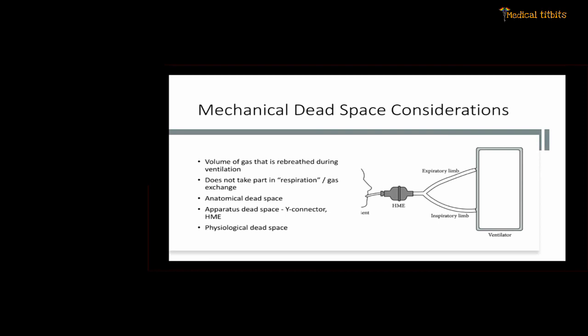So these factors may be playing around. As I said the other day, ventilation, the CO2 washout, depends on the alveolar ventilation, not the minute ventilation. Anyway, for initial settings you can forget about these things, but you get a blood gas to give an idea about the PO2, PaCO2. Take these values also into consideration and then do the adjustments thereafter.